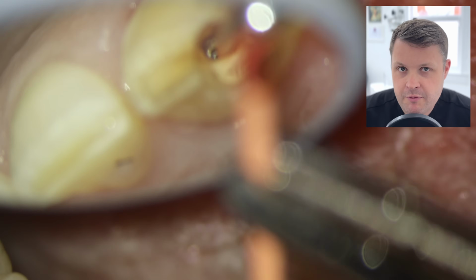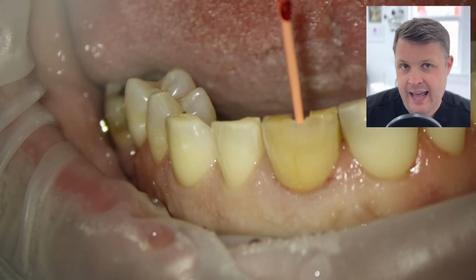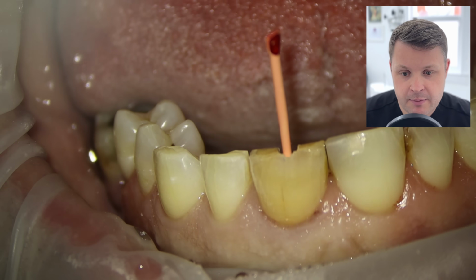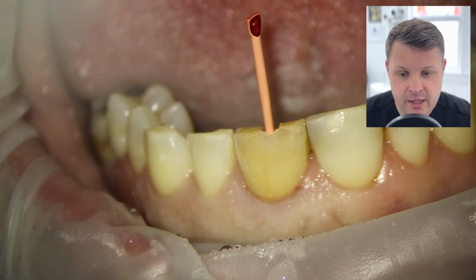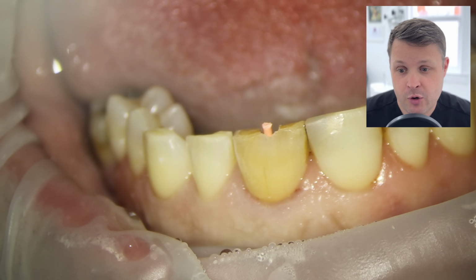So at this point, I can't find any obvious orifice for the canal space, and I am slightly concerned that I am moving quite deep here. And on the cone beam CT scan, we should have been about 12 millimeters where we've hit the correct length. So what I'm going to do is take a GP cone, and place it into the point where we are reaching with our ultrasonic tips.